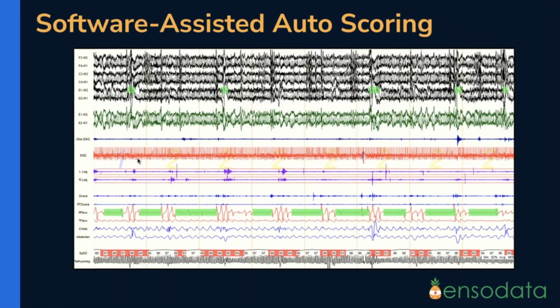And this is how it might look. Instead of opening the sleep study for the very first time and just seeing the raw signals, you might see those events already overlaid on the signals. You can see your arousals, apneas, hypopneas, and the different sleep stages. It's almost like someone did a first pass for you, and now all you need to do is review the sleep study, correct it when needed, and generate the report.